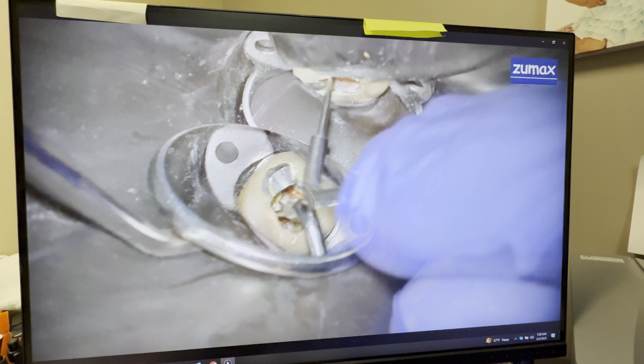All right, so let's go ahead and start with local anesthetic. The girls had already placed the topical for a few minutes. We didn't record that part. Lidocaine is going in, lidocaine with epi. I start with that. Inferior alveolar nerve block.